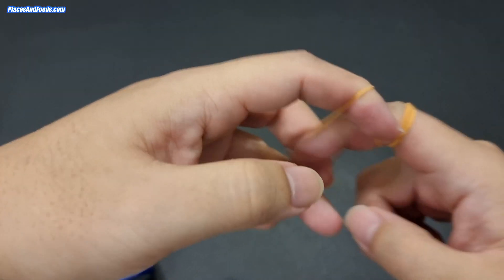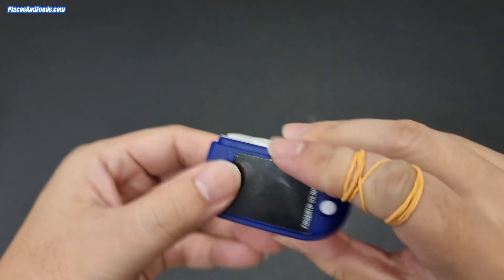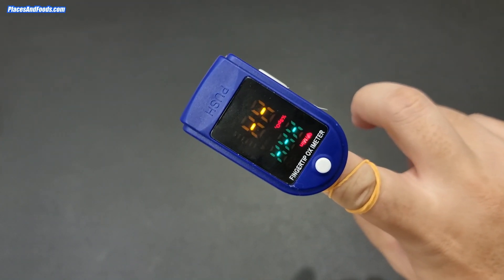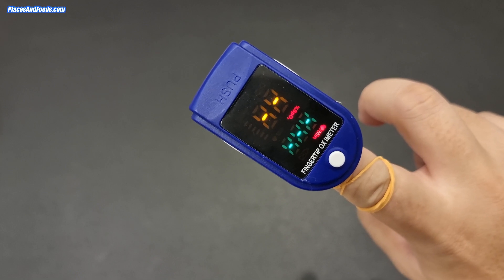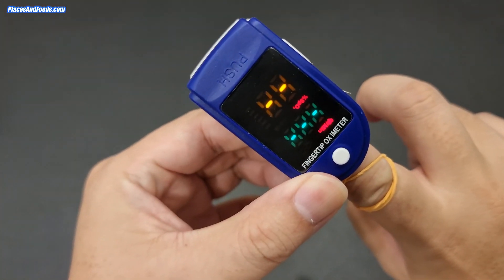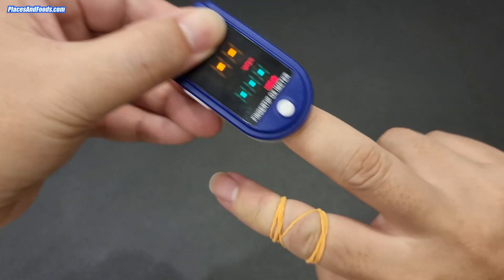To determine whether it works or not, let's do a test. I'm going to take a rubber band and obstruct the blood flow to the tip of my finger. If I tie it like this, there's no blood reaching here, so it shouldn't read any oxygen level at all. Let's try — even pressing harder — and it doesn't read at all. So it works.